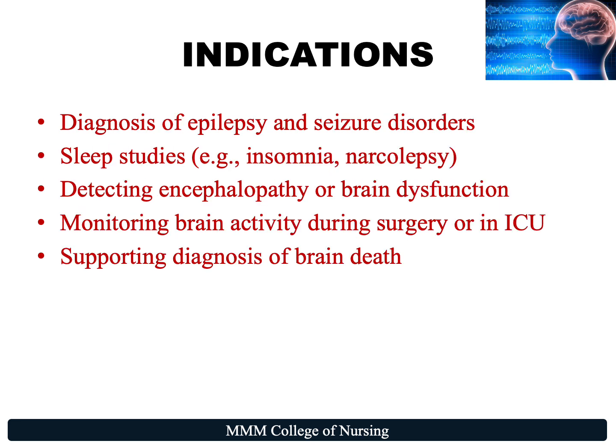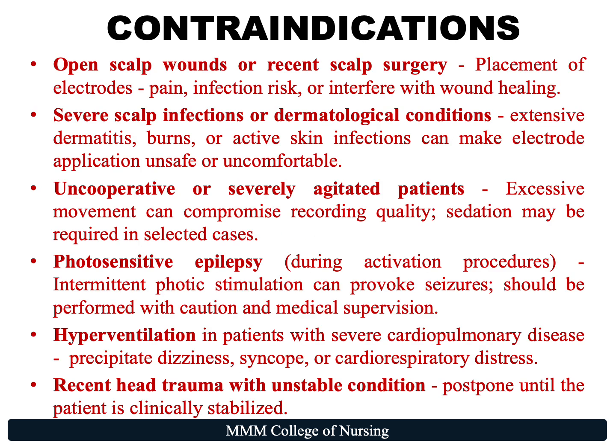Let's look at the indications. This helps in diagnosing epilepsy and seizure disorders, and in sleep studies to assess insomnia as well as narcolepsy, to detect encephalopathy or any brain dysfunction, to monitor brain activity during surgery or in ICU, and to support diagnosis of brain death. There are no absolute contraindications in EEG, but there are a few relative ones.